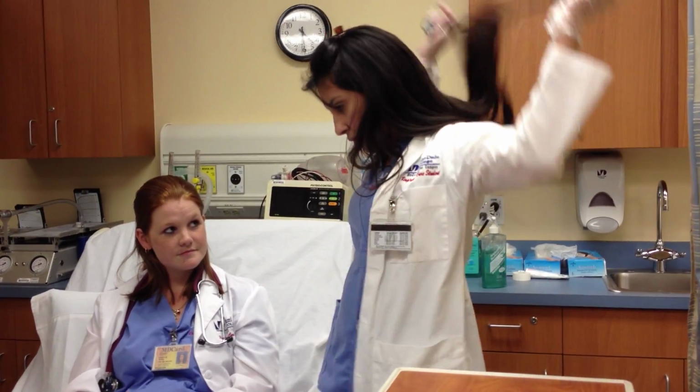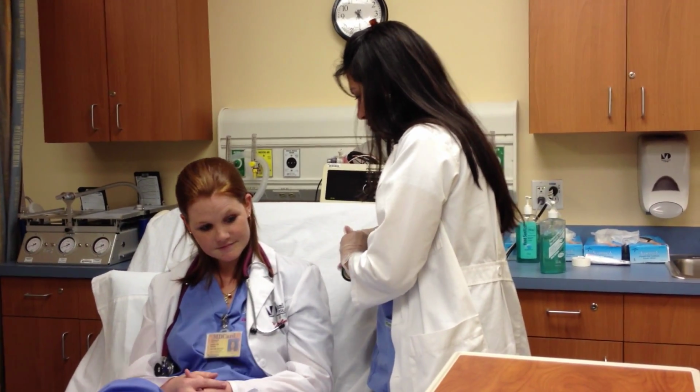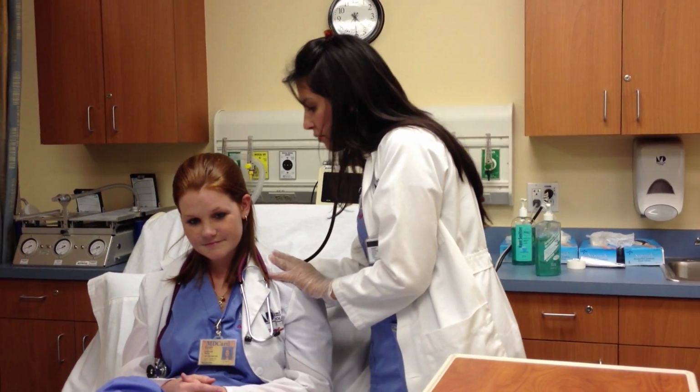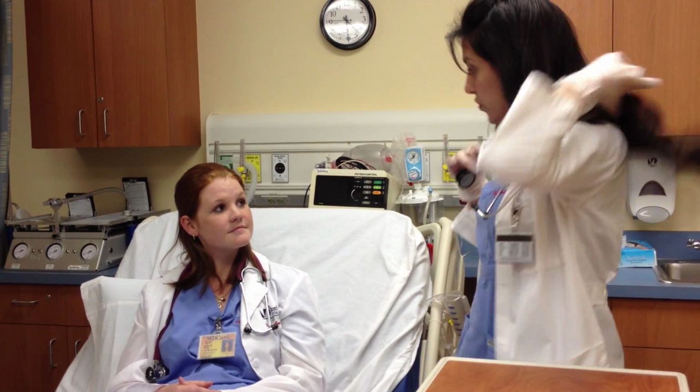Before you leave, you need to do post-vital signs and post-breath sounds. You complete your cycle for breath sounds, and you take your heart rate and respiratory rate. Make sure your patient is safe and comfortable. Krista, do you feel safe and comfortable?